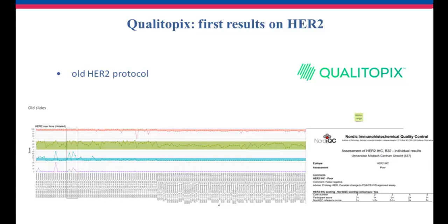Some spikes were even, the 0 goes up to the 1 plus range. You see the same problem is present for 1 plus. It's most of the time quite stable, but in the beginning here, we had some spikes up to the 2 plus region. And that can prompt reflex testing with in situ hybridization, for instance. The 3 plus was most of the time quite stable, but you see the 2 plus was basically quite unstable all the time. And we ran this through the Nordic quality control assessment, and we scored poor, as you can see.